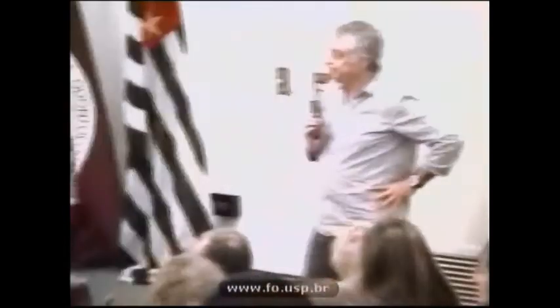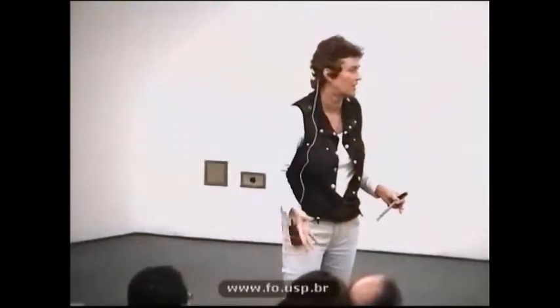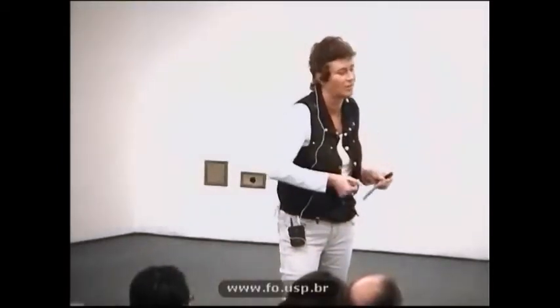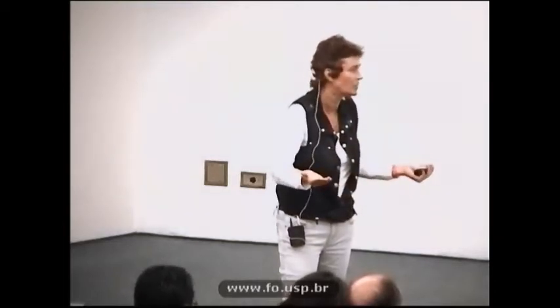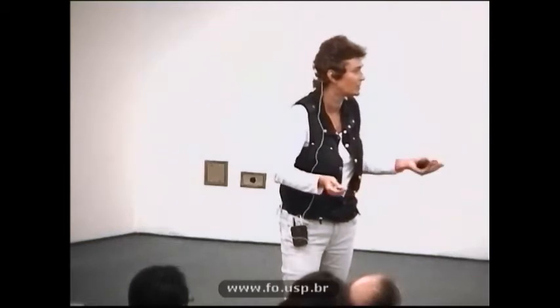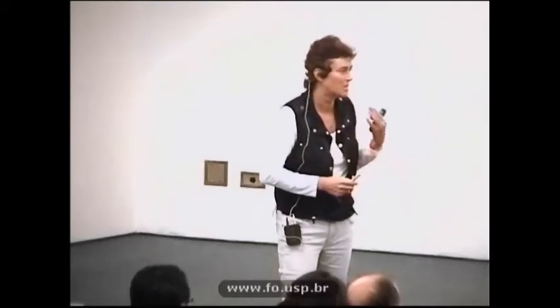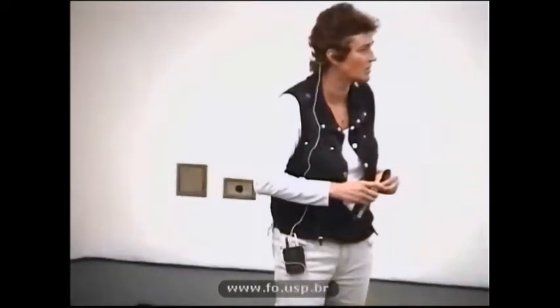I mean, it fails from hoop stresses. Obviously you're pressing so much, you don't have enough space on the axial walls for the cement to flow away, or the adjustment is too tight. So you're pressing and you basically are creating hoop stresses, and it's only alumina, right? So it breaks. You need to create even space distribution, and the minimum of space that we need for all ceramic restorations is 50 micrometers.